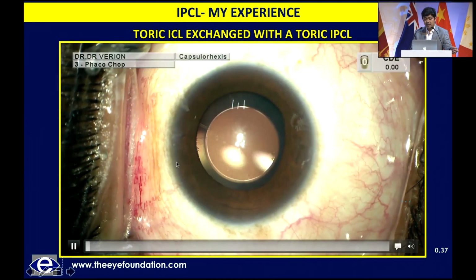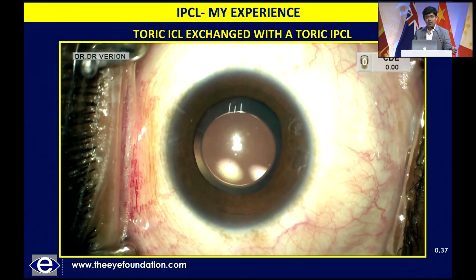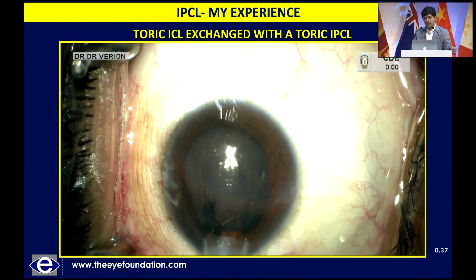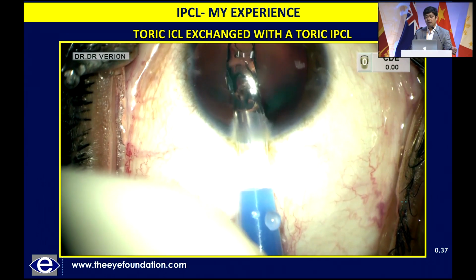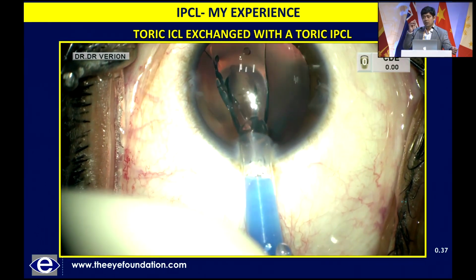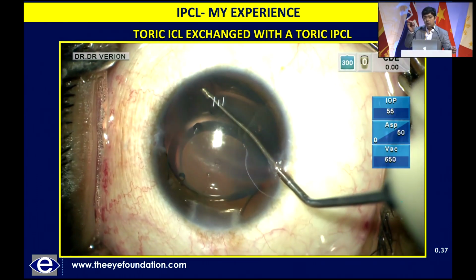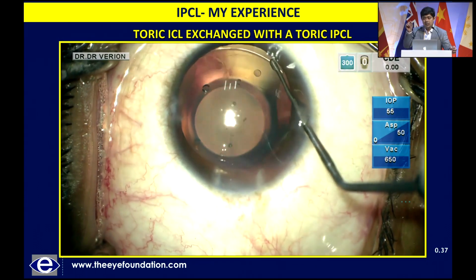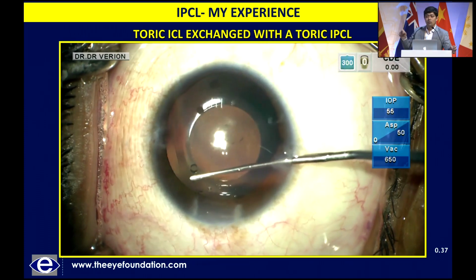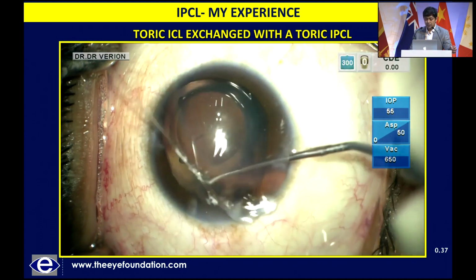And this is a patient who had an ICL and ended up with a little lower vault, and we are exchanging the ICL with an IPCL. Again, because you have these 0.25 millimeter sizing steps, you can really customize. So instead of having just 4 options, you have a multitude of 14 options, and according to the white-to-white of the patient, remeasured, you can have it at 1 millimeter, 1.25 millimeter, 1.5 millimeter over the white-to-white, based on the ACD and the white-to-white of the particular patient.